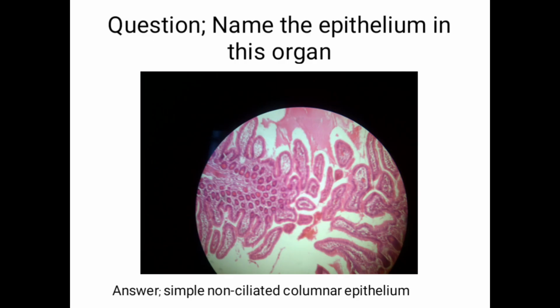And here also you have another image of simple non-ciliated columnar epithelium. You can see in the image it is taller than it is wide, and the nuclei are at the base.